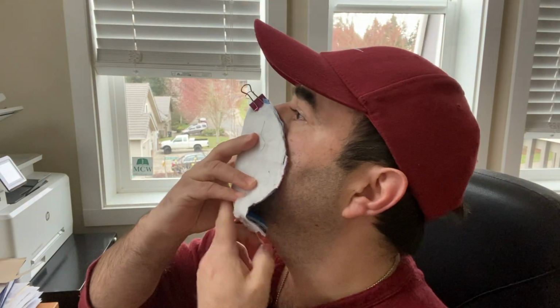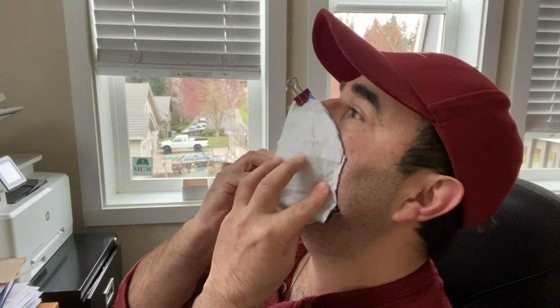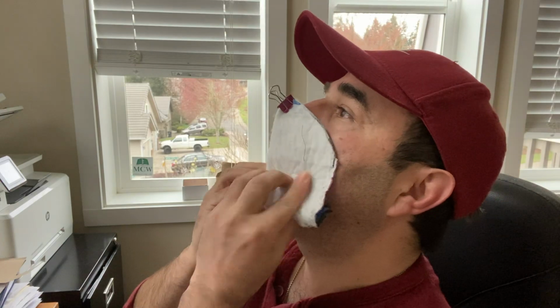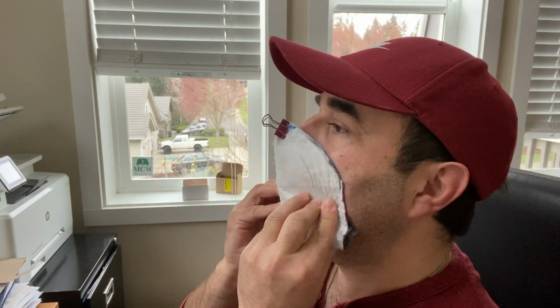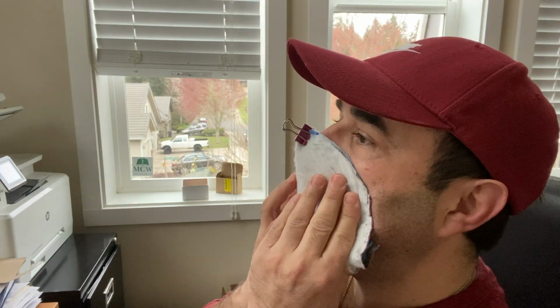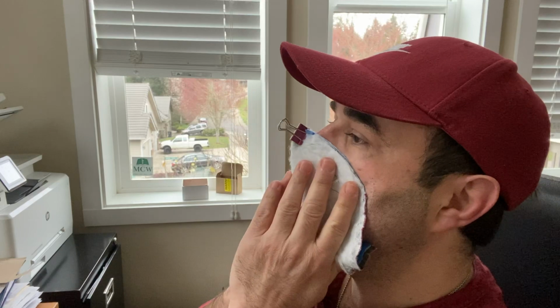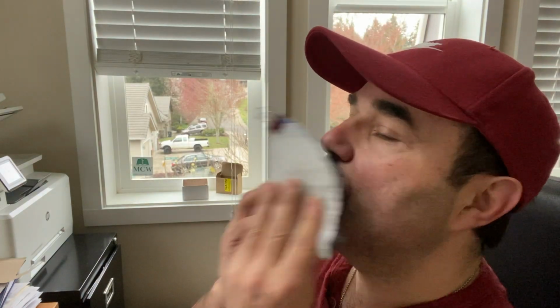So the next step is that you'll start folding it like a sandwich along the cheek. You'll want maximal coverage under the cheek. So you start flattening the sides like this. And you're going to almost want to be like you're pinching your own skin. That's how close you want it, because you want this as tight as possible against your face so that there are no breaks in the seals. And because of the wire in the mesh, it really holds its shape.